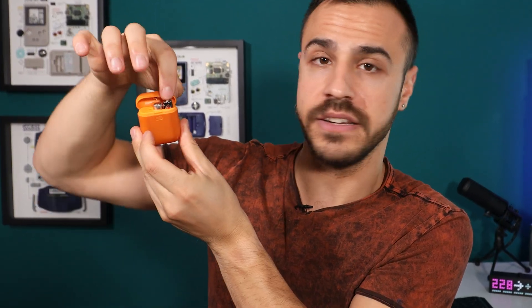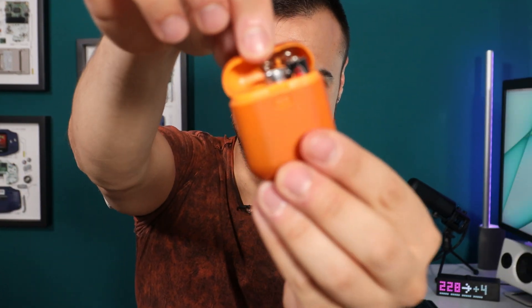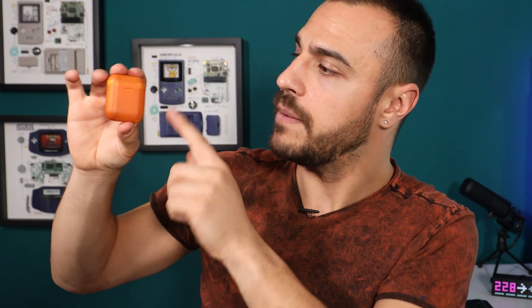If you're using older Omnipod models — not the Dash, but the Eros — you will need a device like this. This is an OrangeLink, basically a receiver with two AAA batteries. It allows the older Omnipods to connect to a phone. With Omnipod Dash, which is what I use now, I don't need this anymore. I highly recommend if you have the option, go with Dash because that will connect with your phone over Bluetooth.